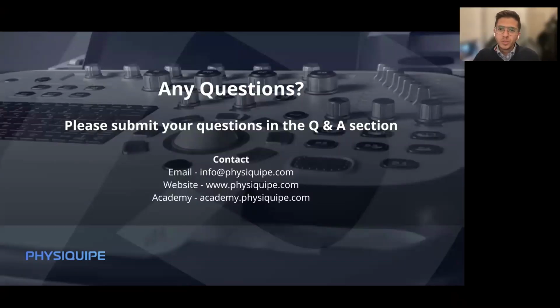So bone edema, unfortunately, you can't call at all on ultrasound. The ultrasound waves stop at the bone and bounce backwards, so you essentially can't see into the bone. For bone edema, you really need the MRI scan, particularly T2 weighted imaging and STIR sequencing to specifically look for bone marrow edema, particularly in your bone stress injury cases. You can sometimes see a small cortical breach in the higher grade bone stress injuries. If you're familiar with the Fredericson classification, your grade 4 essentially up, when there is a cortical break, you can sometimes pick that up on ultrasound, not always. That's your limitation with using ultrasound to look at bone. And then obviously the other changes we talked about in terms of osteoarthritis changes. But bone marrow edema, sadly, is not possible on ultrasound.